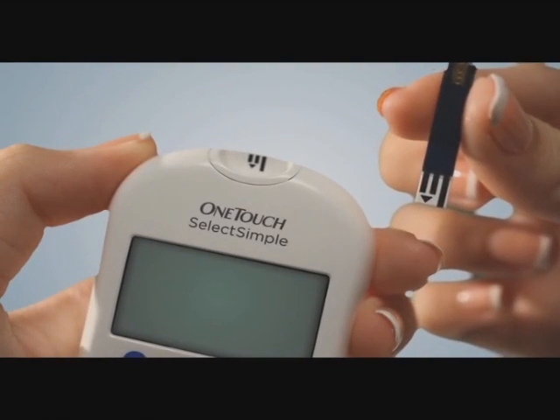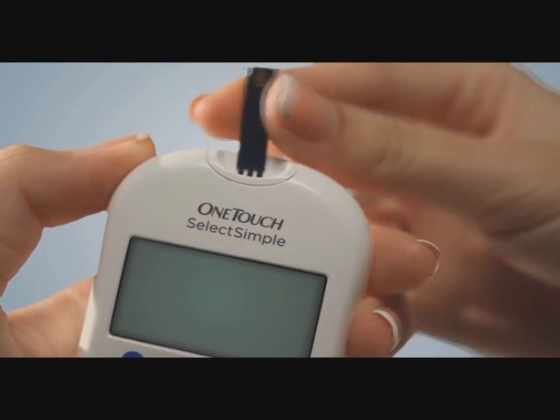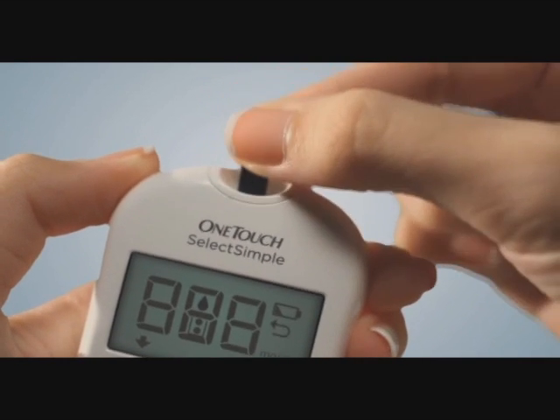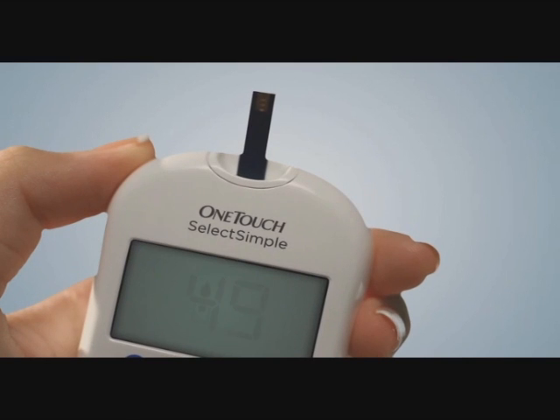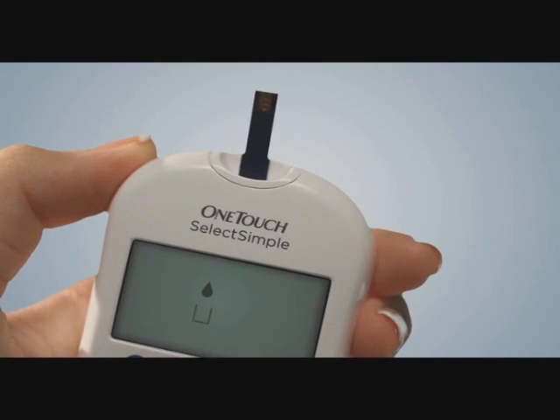Here's how it works. Insert the OneTouch Select test strip into the OneTouch Select Simple meter. You'll see your last test reading, after which a droplet icon will appear. This means the meter is ready for your blood sample.